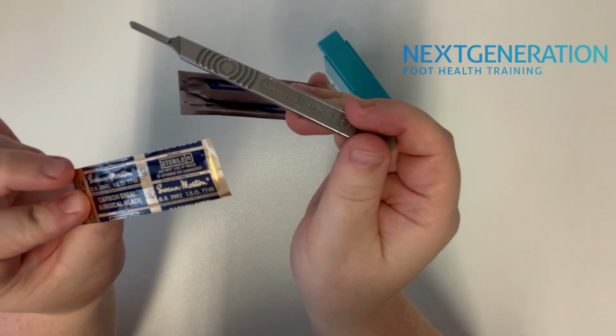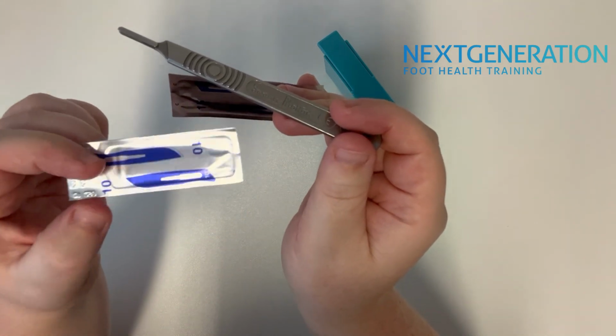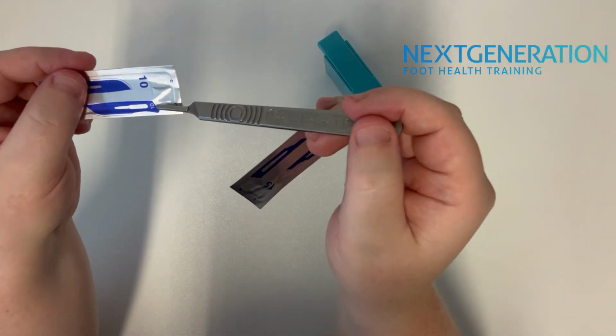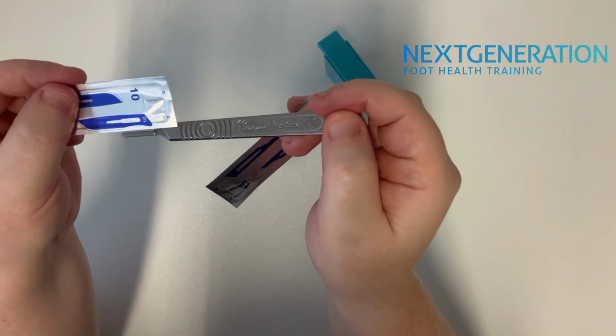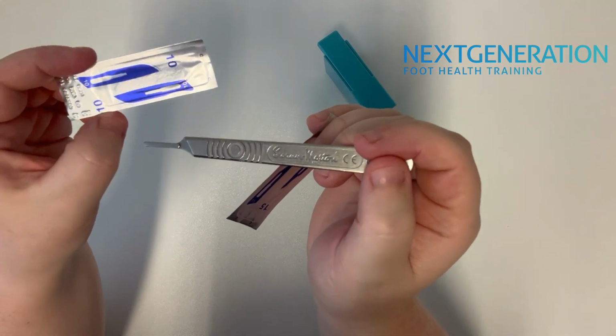So you can see on one side we've got the Swann Morten logo and also more of a gold side, and on the other side we've got the silver side, and it also shows you the blade as well. So what we need to concentrate on is that angle of that blade matching up with the angle on the handle piece, so that's why we need it Swann Morten side facing up.